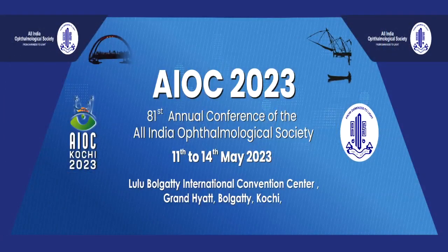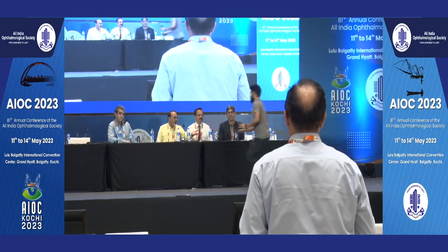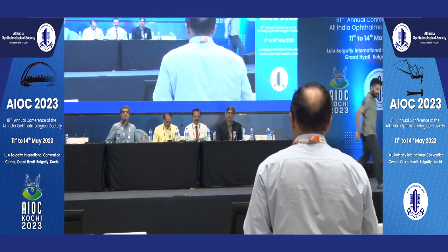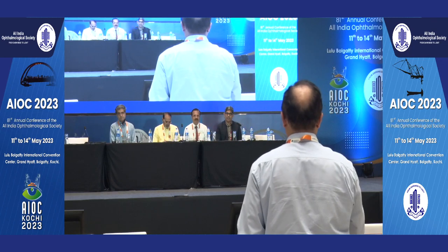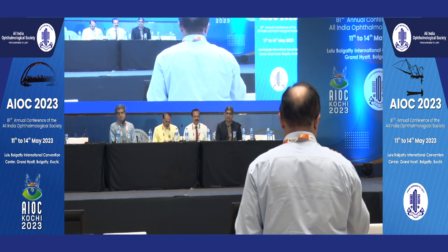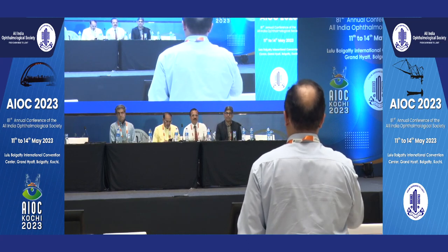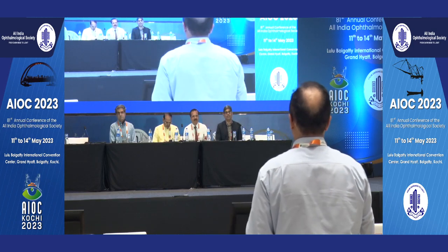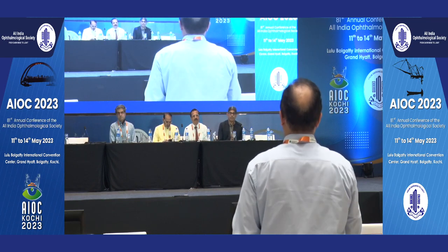Thank you for a very illuminating advancement in technology. I personally use the Callisto system, and I have one problem which I hope the panel can clarify. The main thing about Callisto is that you do the registration, and you have everything on the table itself. When you press the button on the foot pedal to see whether you can get the Callisto readings on, you find that it's not recognizing it. That means the Callisto, for all practical purposes, is not available for you at the actual time when you're doing the surgery.